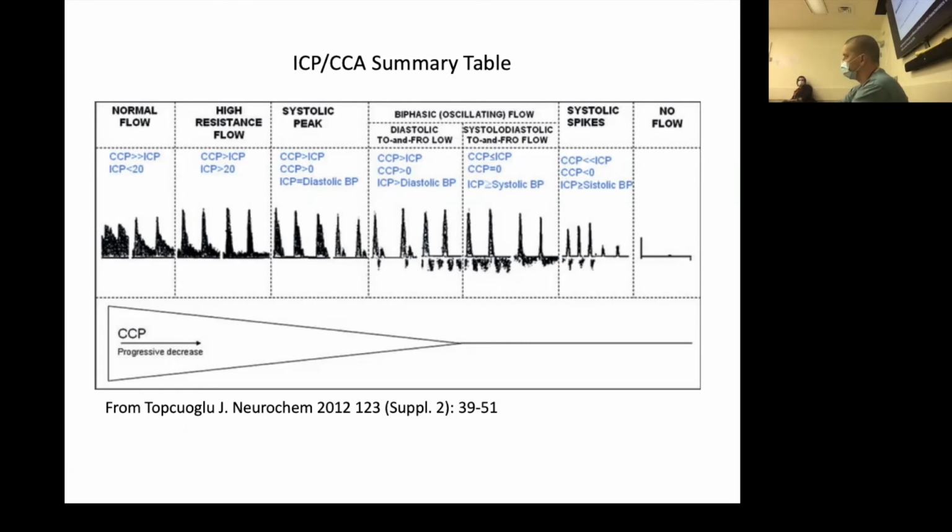I think the problem is that if our gold standards are invasive gold standards, we have challenges with using this technology because we don't have a monitor in place. So I think that will probably change over time. But in most cases, a combination of techniques is probably warranted because the sensitivity just isn't high. But certainly, as Dustin pointed out, the specificity is reasonably high.